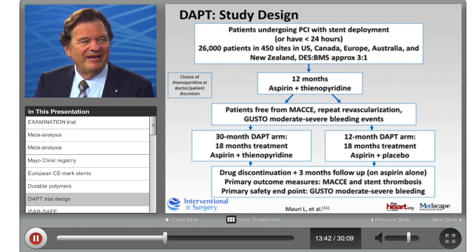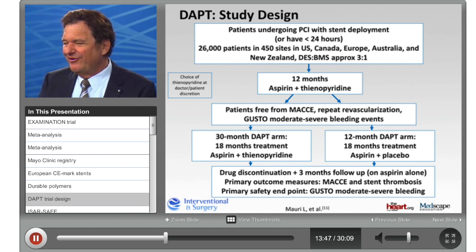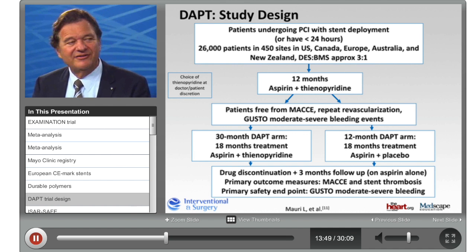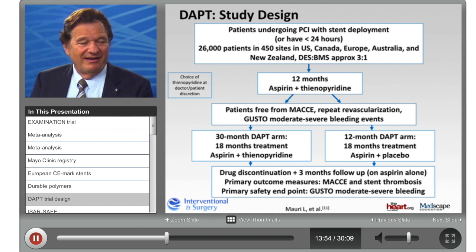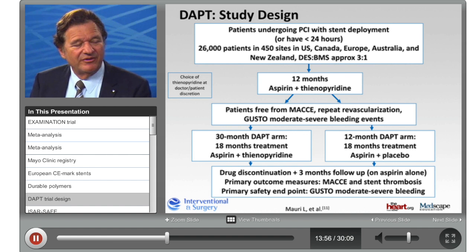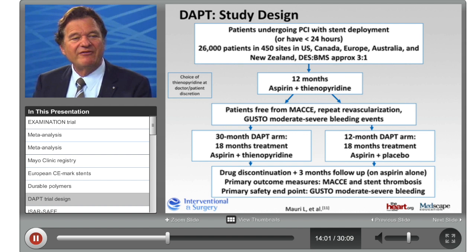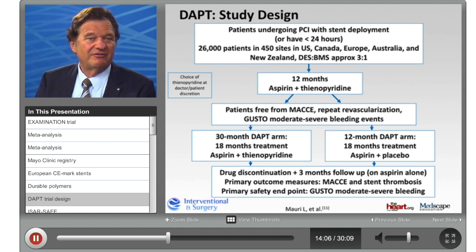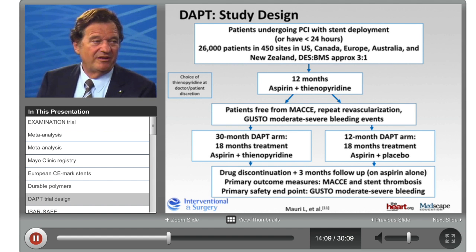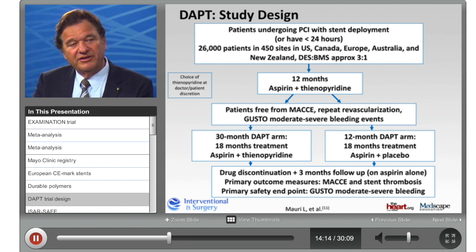Yeah, very much so. May I be a little bit provocative? Yes. Is this allowed? Okay, because the Americans talk all about the DAPT study. It's a huge study, the largest study, over 20,000 patients. I have to admire you for performing such a study with over 20,000 patients. But, and here comes my but: the patients are randomized after 1 year of dual antiplatelet therapy. And I'm personally not so much interested, because after 1 year, anyway, we discontinue after 6 months according to the European guidelines. So if you stop or continue after 1 year, this is really not our everyday practice.